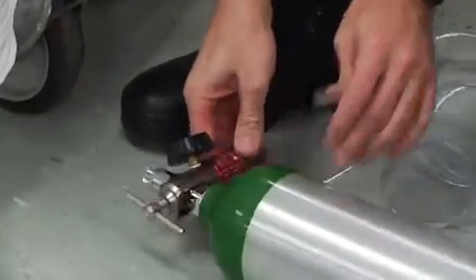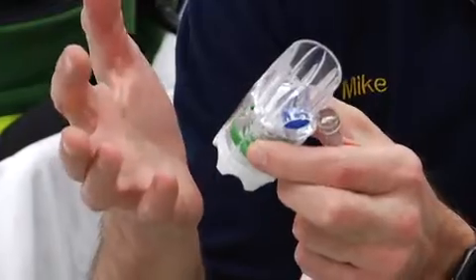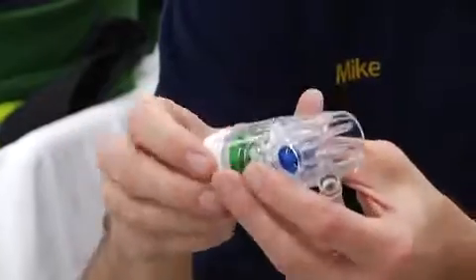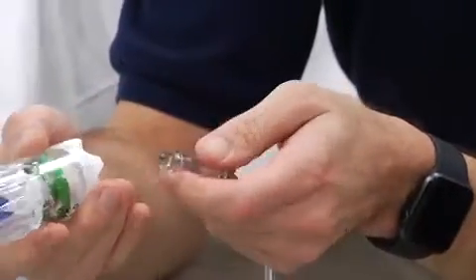We'll attach it to the oxygen and connect it to the actual CPAP device. You have a choice of pressures to start at — we're administering CPAP in centimeters of water pressure. Typically we would start somewhere between 5 and 10 centimeters of water pressure. Lower pressures are used initially because of the uncomfortable nature of CPAP. If you put high pressure on somebody instantly, they're not going to tolerate keeping the mask on. In this case, I'll set the device at 7.5 centimeters of water pressure.